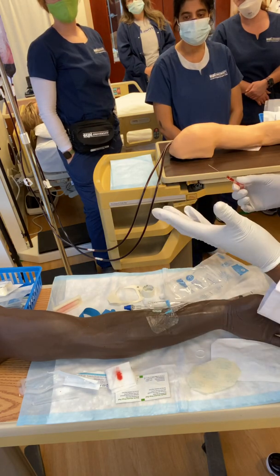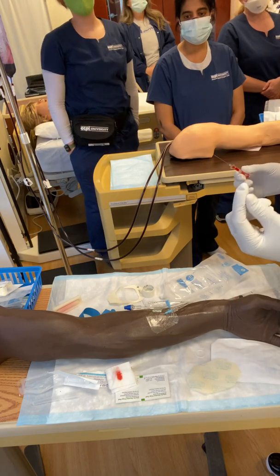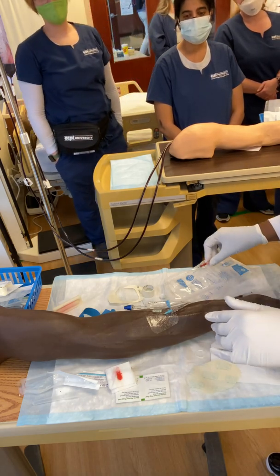When you get in a hospital setting, you have a big vein, you don't want to use a tiny needle. It just is no point.